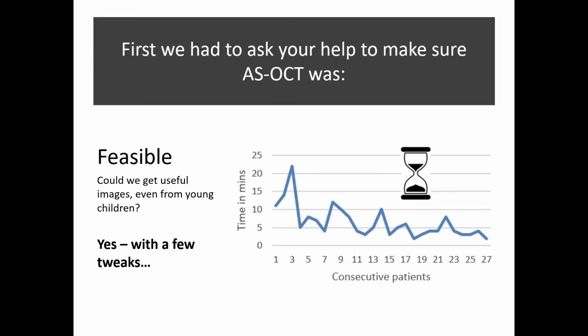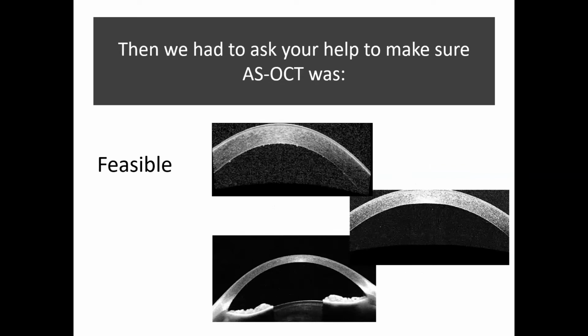It took us a bit of time to work out how we could use the scans and not take that long to get them. Obviously we're not going to get a very young child to sit at a scan for 20 minutes, but for maybe 2 minutes, we've got a better chance of getting a good image. The next question was, could we get useful images across different machines? You can see there are slightly different images produced, but we thought they were all showing us what we needed to find.